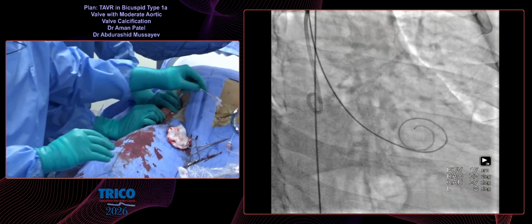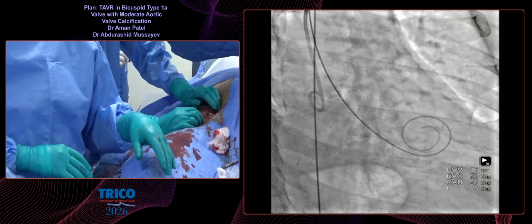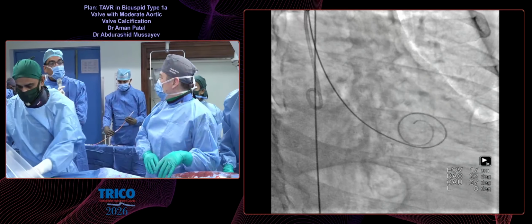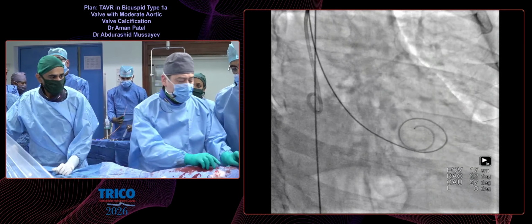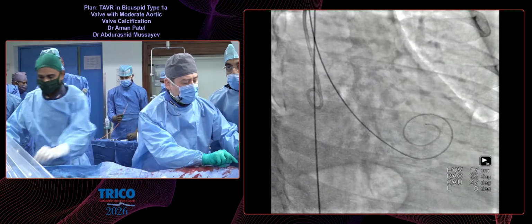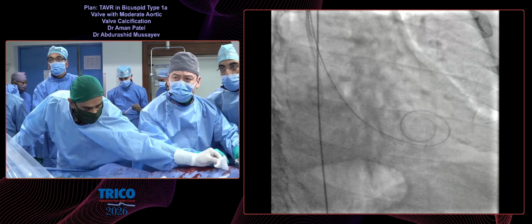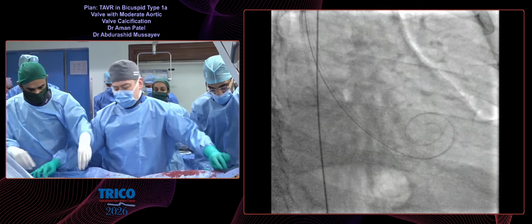So Professor, when do you do the pre-balloon shot? Do you do the aortography before, or after the balloon valvuloplasty? Before, yes. Aman, it's interesting. You do not put a temporary pacemaker over there. How comfortable are you to pace over this extra small safari wire?